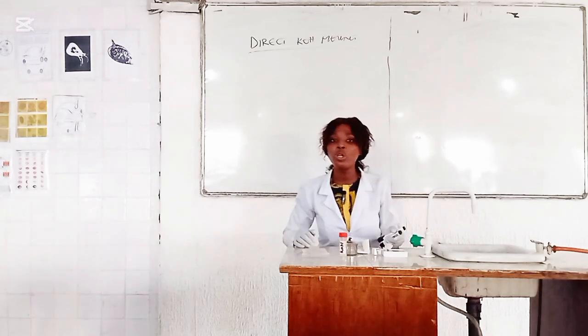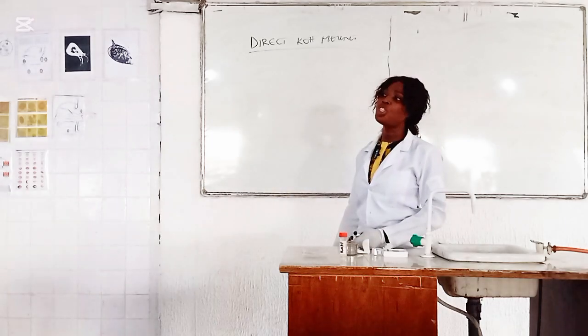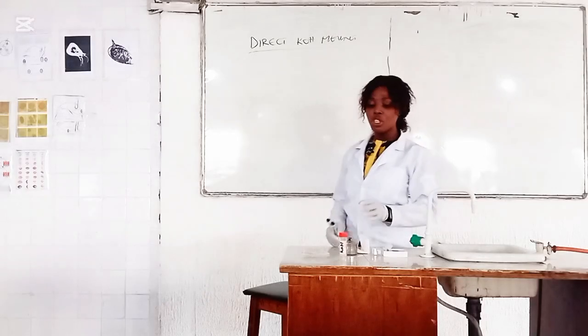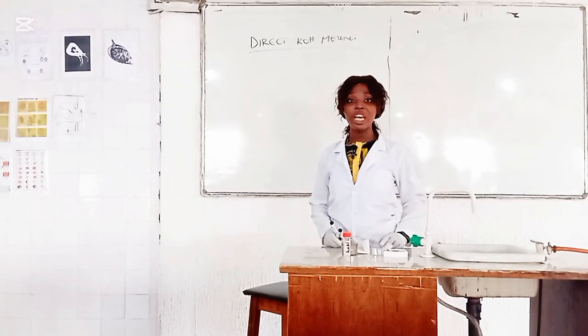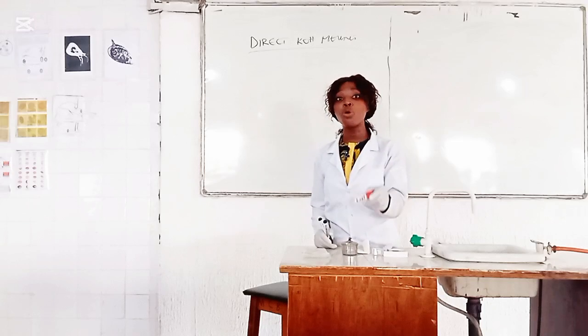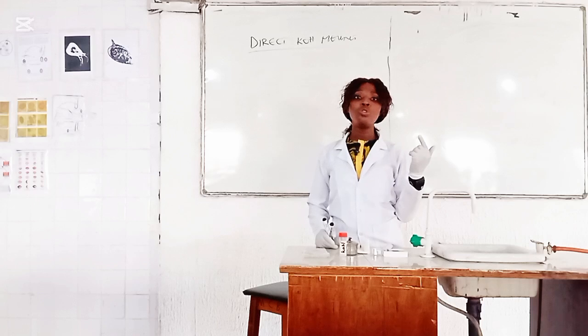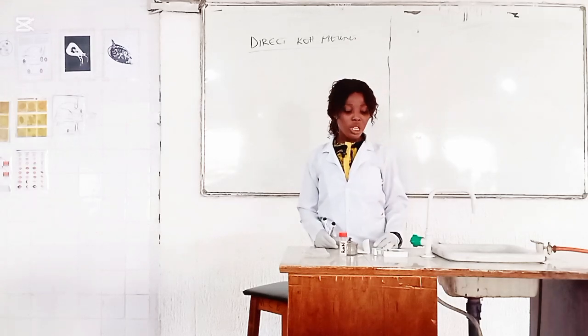But first of all, we need to know what you are expecting to see, the shape of the fungi and how it looks. Regarding KOH, potassium hydroxide, you must remember that it is corrosive, because when you are working with it, you have to know the danger involved in the different reagents you use.